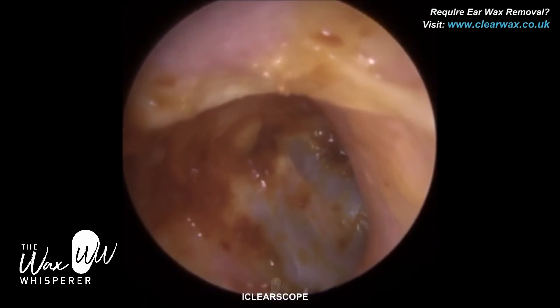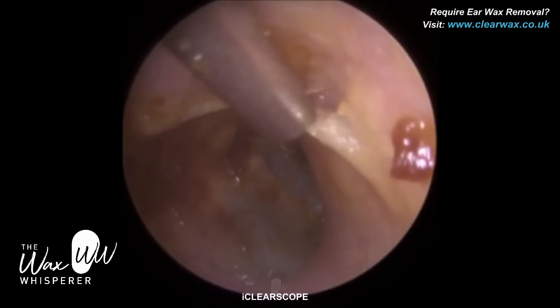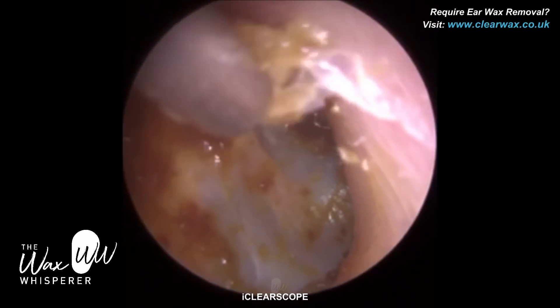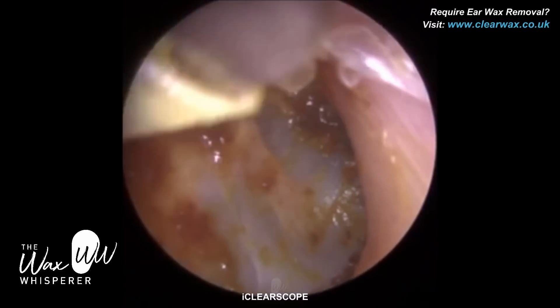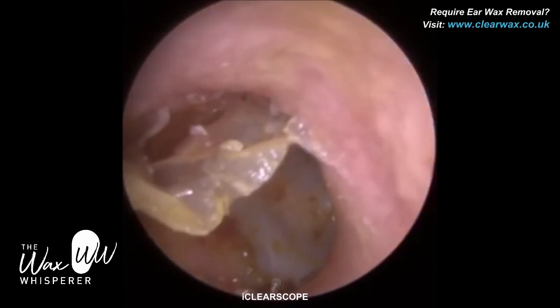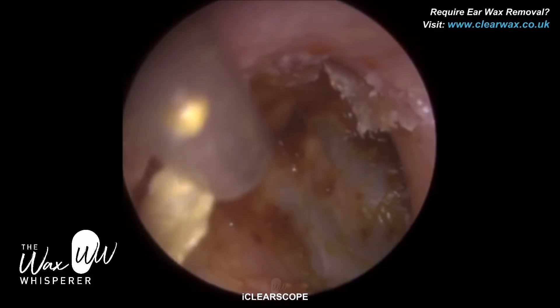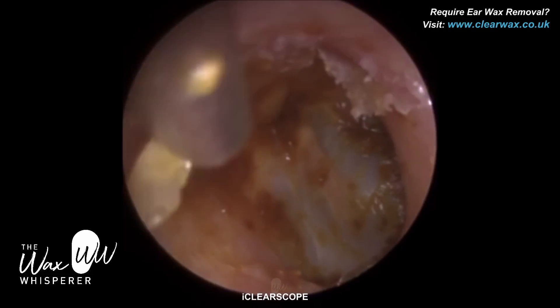These recesses are created by the narrowing of the ear canal about half a centimetre from the eardrum. The ear canal narrows and then protrudes back outwards, and that narrowing and protrusion creates recesses, trenches, and craters all the way around the eardrum — but generally inferiorly, at the base of the eardrum, and anteriorly. Anteriorly is the front part of the ear canal: for the right ear it's on the right-hand side, and for the left ear the anterior portion is on the left-hand side.